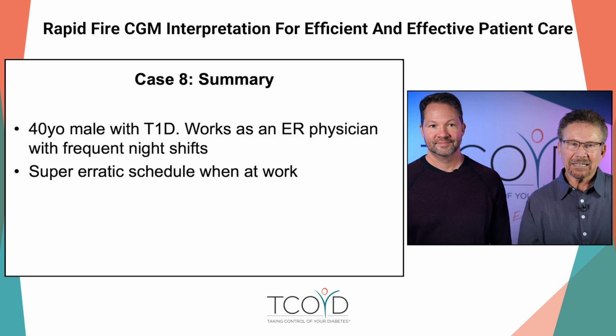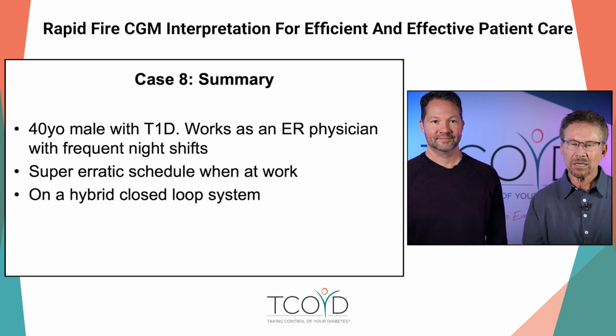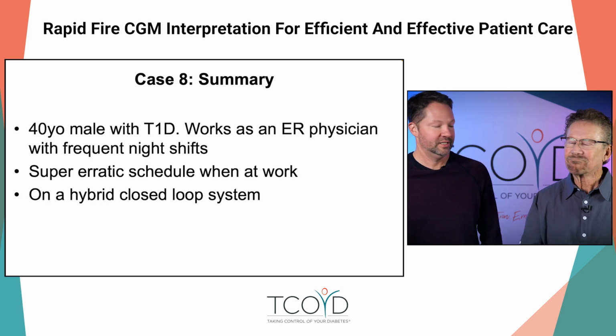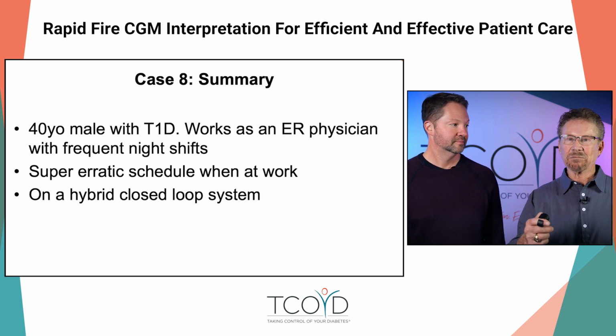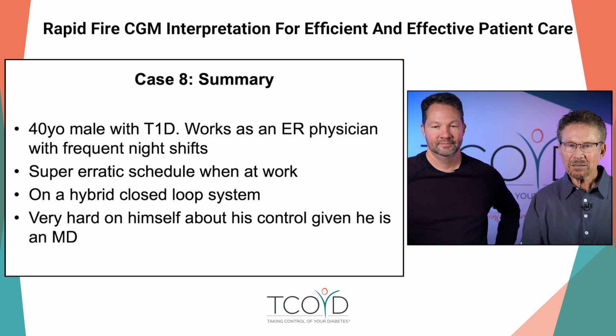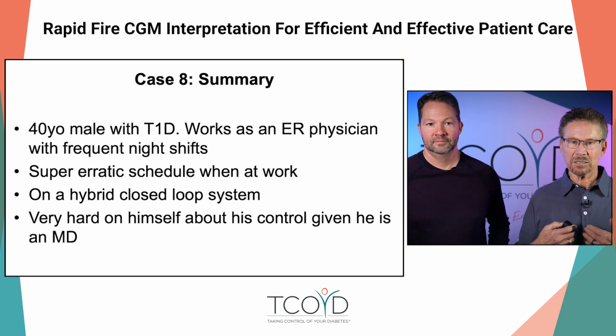Okay. And just to summarize, he's 40 years old and works at night. Yeah, okay. The night shift, yeah. And he has super erratic scheduling at work. He's on a hybrid closed loop system, which is working well in the day, which is when he's sleeping. Which is like most people in reverse. Just flipped, yeah.